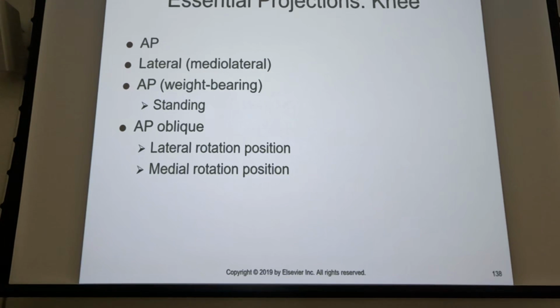But we're going to do weight bearing here as well, and we're going to do 2 obliques, and then we're going to do some specialty views for the intercondylar fossa.